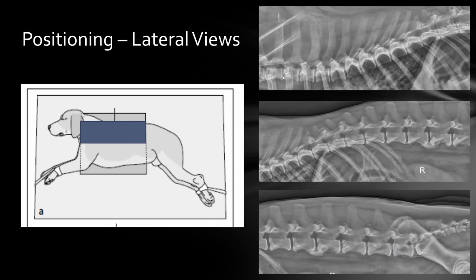These are very nice straight lateral views of the thoracic spine, centered on the thoracolumbar junction, and then centered on the lumbar spine. So again, if everything works optimally, you want to see as many disc spaces as possible straight on. But even in this case, you see that some of those are beautifully seen with the tangential X-ray beam, while others are just a bit more distorted the further you go into the periphery of the X-ray beam. But these are otherwise good radiographs.